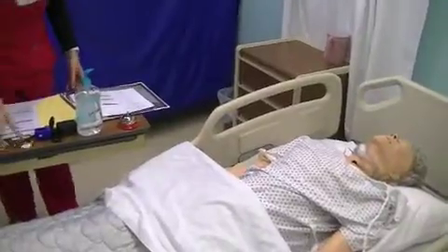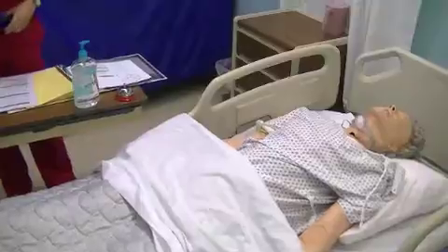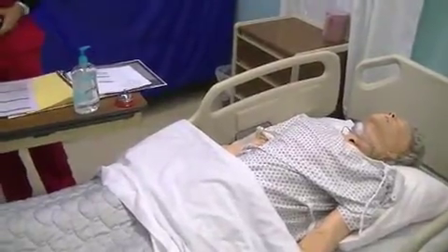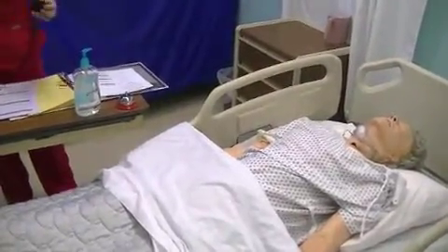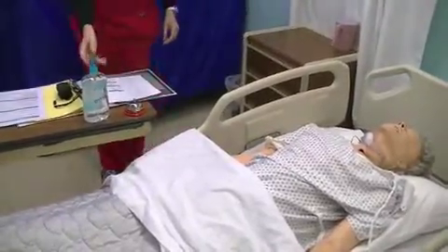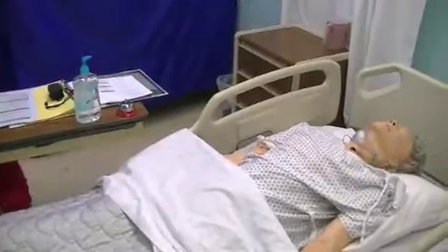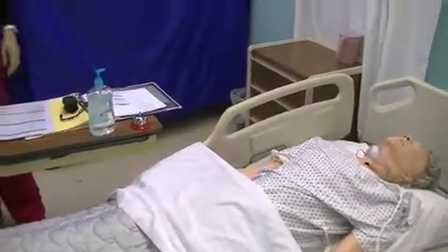And we're going to make sure we dispose of any equipment that we used. And we're going to put this away. And we're going to make sure that we wash our hands before leaving the room. And any abnormals we're going to report to the nurse instructor.